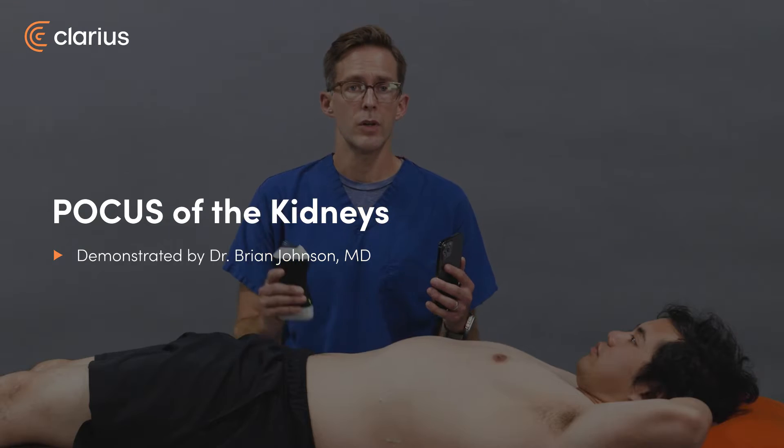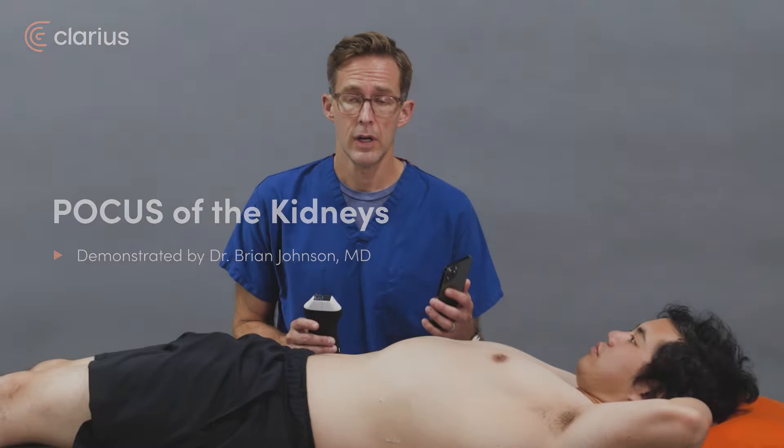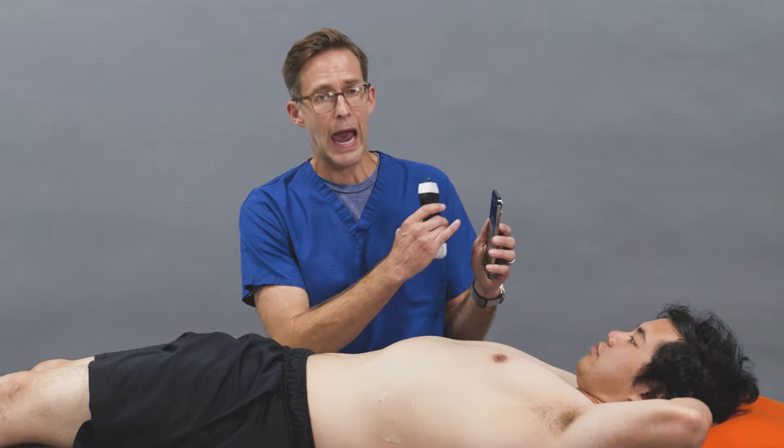Hello, I'm Brian Johnson. Today we're going to use the Claris Pal to assess the kidneys for hydronephrosis. I have my phone here in the Claris app and you're going to want to preset an abdomen.